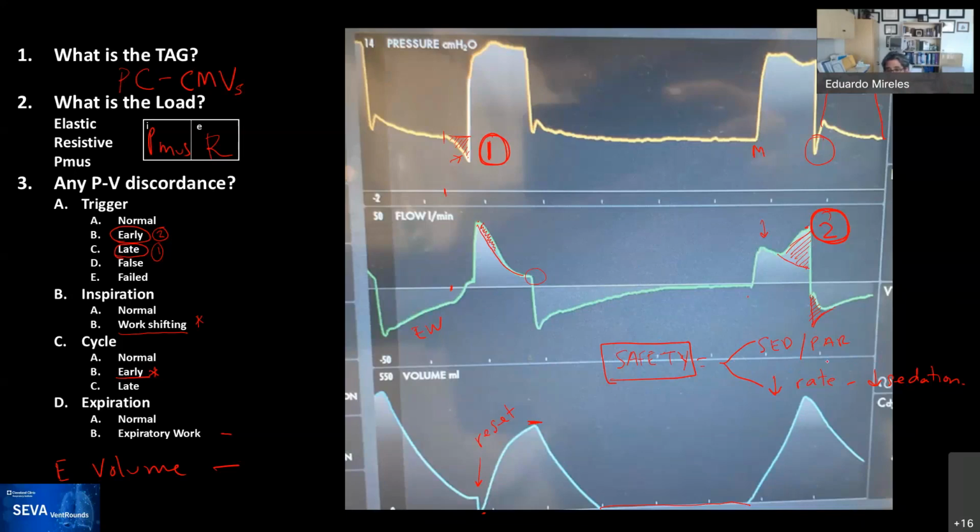So many times we end up having to make a decision: if the goal is safety and the patient is generating very large tidal volumes or very large PMUS, it is to paralyze the patient. And I'm being careful when I say paralyzed, because many of these patients are already at a RASS of -5, and going higher will only make them more toxic in my point of view. But I'm just putting it out there for comment.